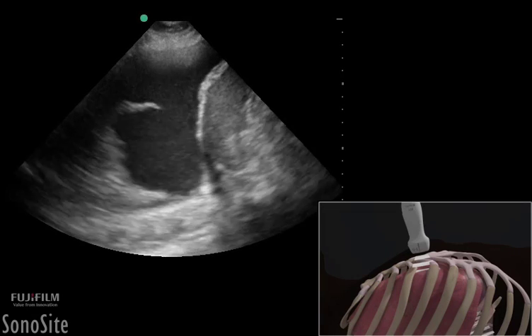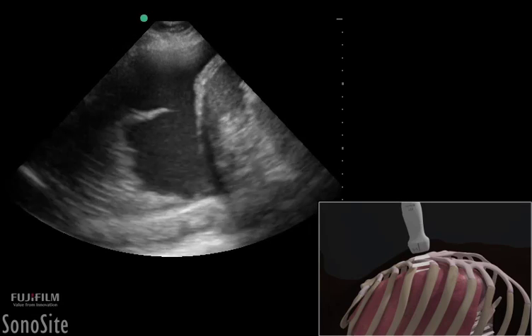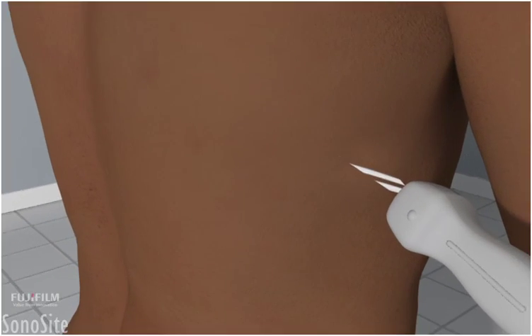The third topic of pulmonary ultrasound is the utility of ultrasound to evaluate for pleural effusion. Ultrasound has been shown to effectively detect and quantify pleural effusion. There are two traditional patient positions for pleural effusion evaluation: 1. Sitting position, and 2. Supine position. It is important to note that the sitting position will allow the majority of lung tissue to be examined and allow the majority of the dependent area to be scanned in a single ultrasound plane.